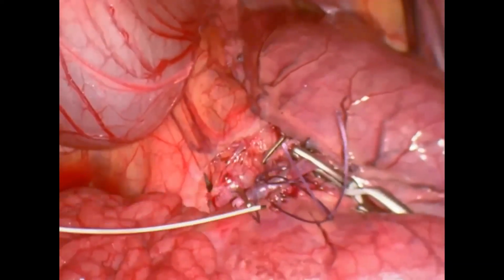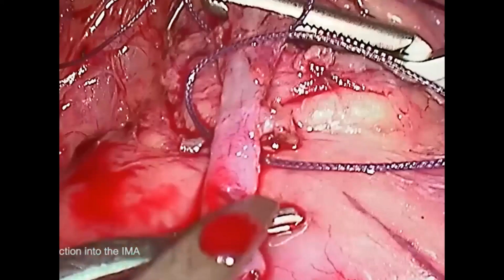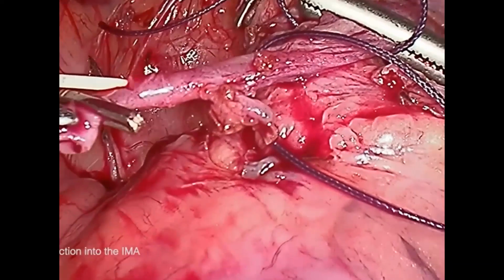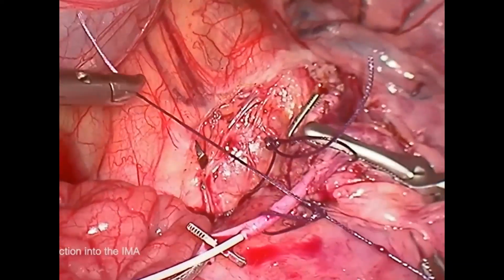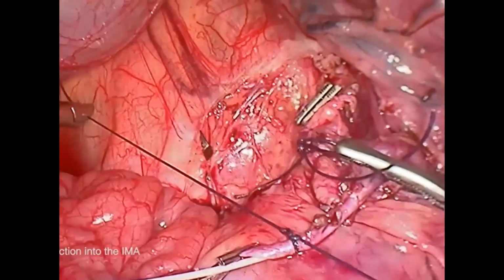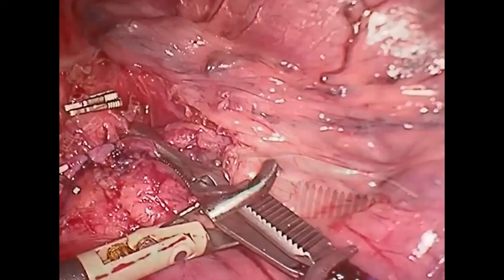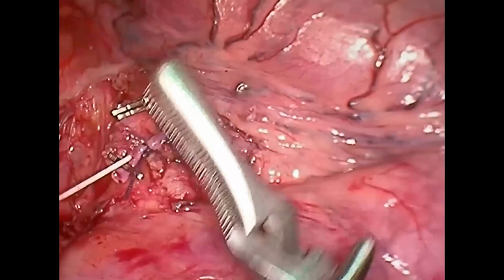So after applying a bulldog, we make an arteriotomy, and then we cannulate it and push the dye. Before pushing the dye, we will release the bulldog clamp. So that has been cannulated. We have ligated over the catheter so that there will be no backflow and leakage of the blood. So we are removing the bulldog clamp, and then we are instilling the dye.